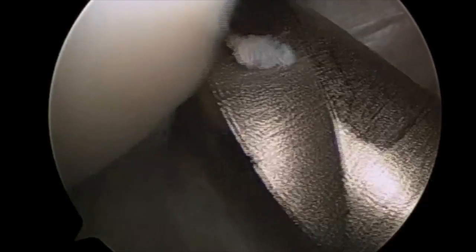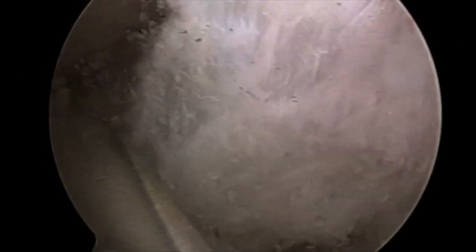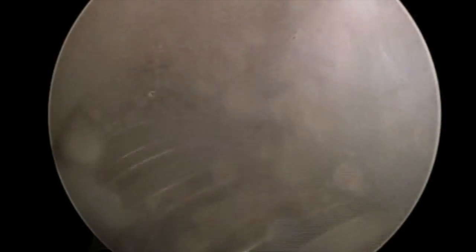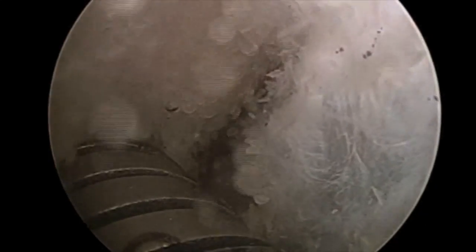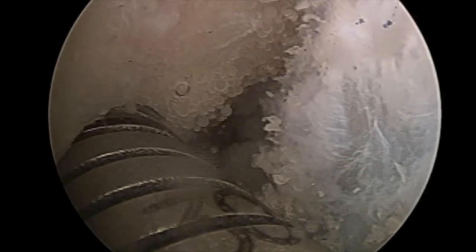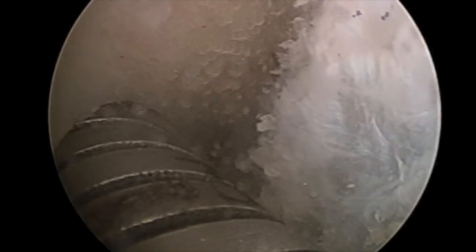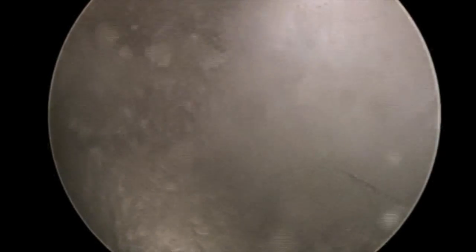The flexible reamer is then advanced to the femoral wall and a femoral tunnel is created. In a soft tissue graft situation, 25 millimeters of depth is ideal. The marking of the 25 millimeter depth is visible here, and the reamer is advanced so that 25 millimeters of the graft can be docked into the socket that is created.